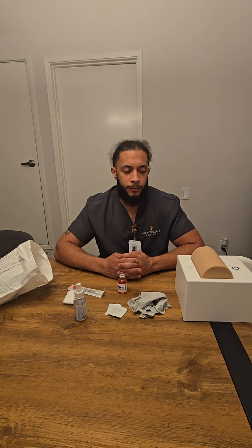Heparin is a subcutaneous injection that is a blood thinner to prevent blood clots from forming in your blood vessels. When I administer this injection, you might feel a sting or a burn, which is normal. It goes away with time. Common side effects are that you might get easily bruised, and if you fall and get hurt or get an open wound, there's increased bleeding time.